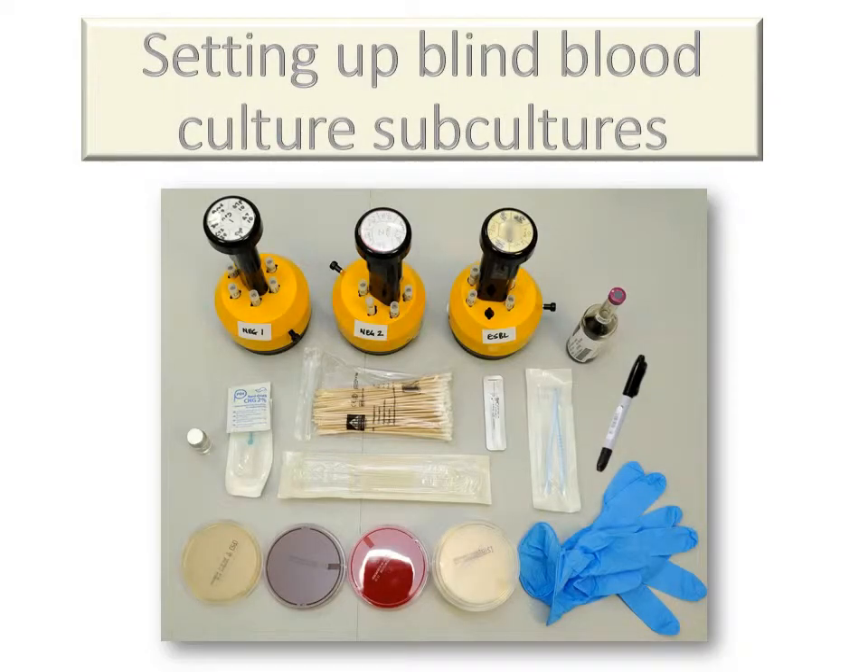The purpose of this presentation is to provide a brief resume of the methodology for those undertaking blind blood culture subcultures.